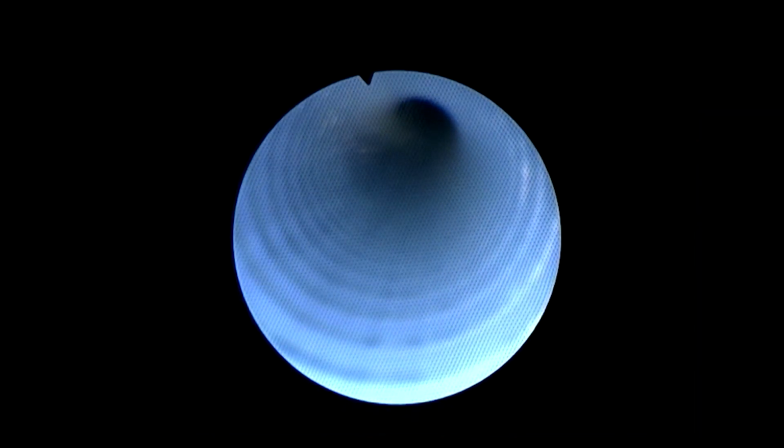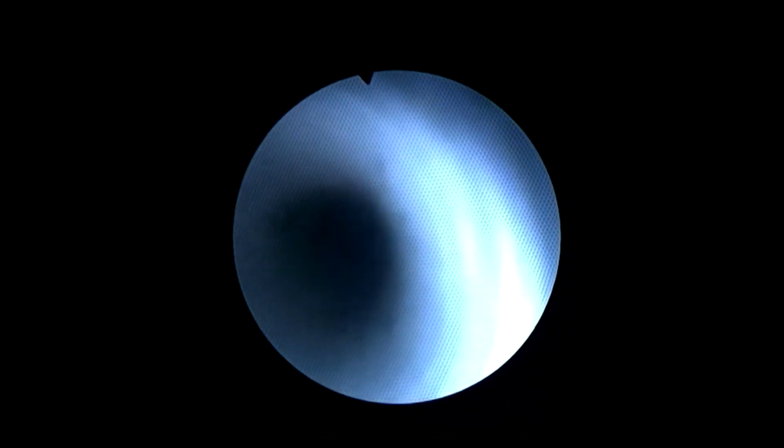This is the endoscopic view that we see on the left-hand side. You can see that we're going down the access sheath here. We can then go down antegradely. You can see the mucosa is a little bit inflamed, which you might expect in this patient who's had nephrostomy tubes in for some time, but unfortunately there's no way through into that anastomosis.